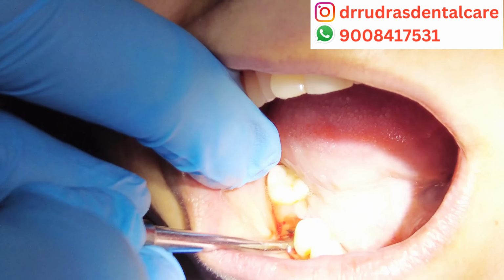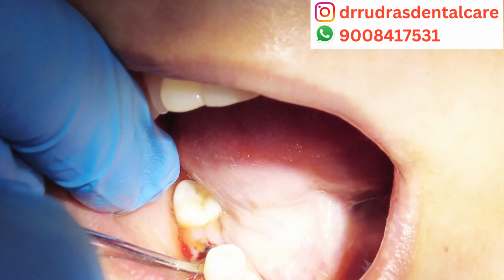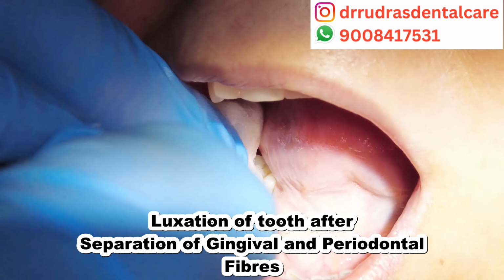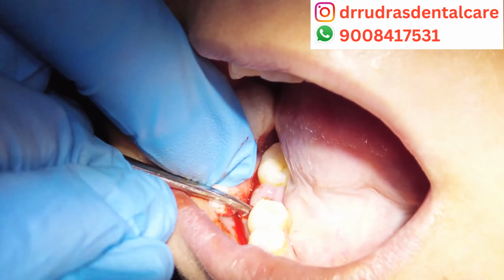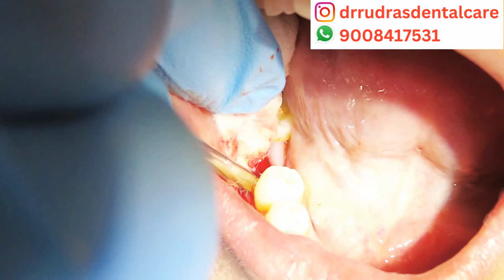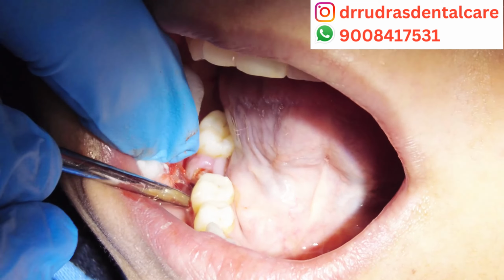So now what we're doing is we're using a periosteal elevator to separate the gingival fibers, the gum fibers, the periodontal fibers rather, from the attachment of the tooth, and making sure that we can use a wedge and a lever principle to make the tooth mobile and we can take it out. Now you have to understand that this is not as easy or as simple as it looks, because all extractions can become complicated extractions because of various reasons.